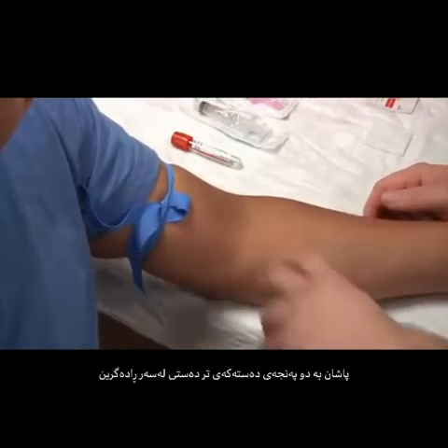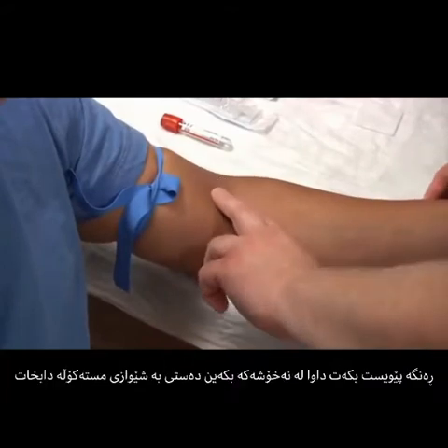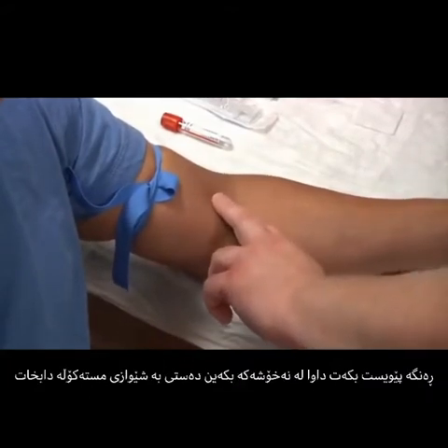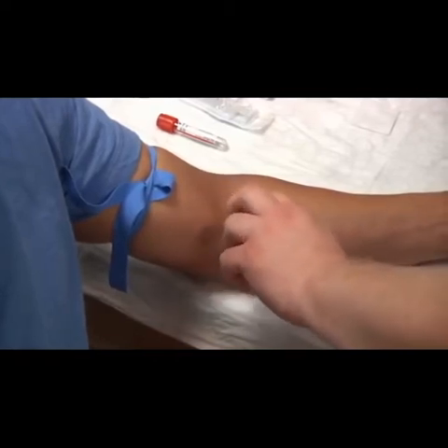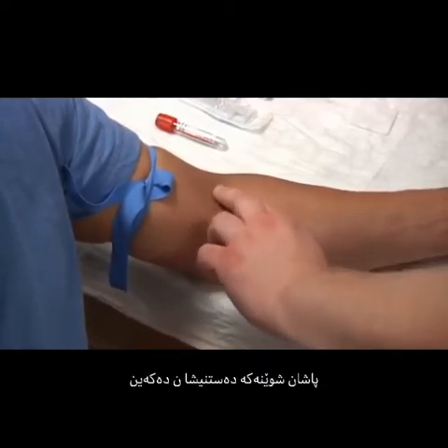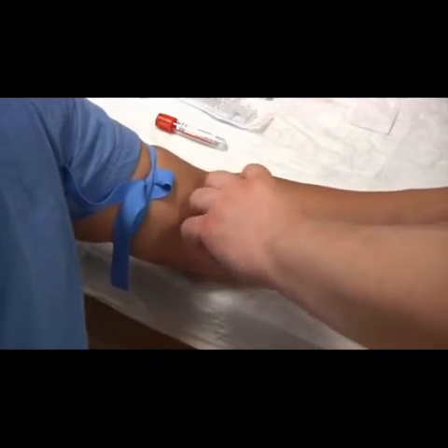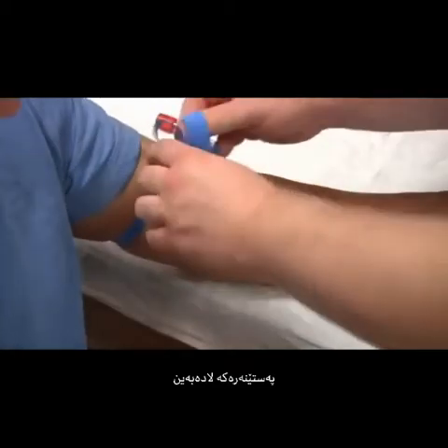We're going to palpate with our two index fingers of our non-dominant hand. We may need to ask our patients sometimes to make a fist. I found my vein of choice — let's go ahead and landmark. Release.